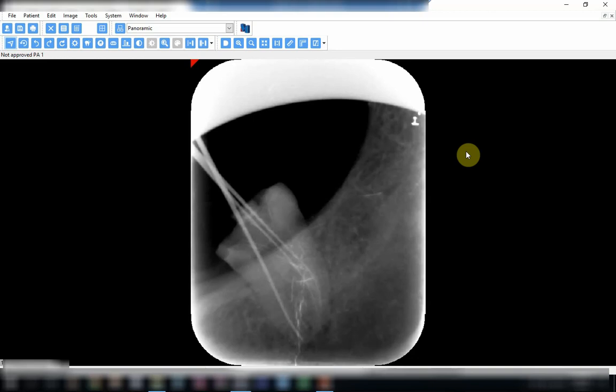This radiograph shows an error that is mostly faced with the angle bisecting technique, and this is the incomplete coverage of the X-ray sensor by the X-ray beam. As we know, the X-ray beam only exits from the PID or the position indicating device, and it is only the inside of the cone that allows the X-ray to pass.